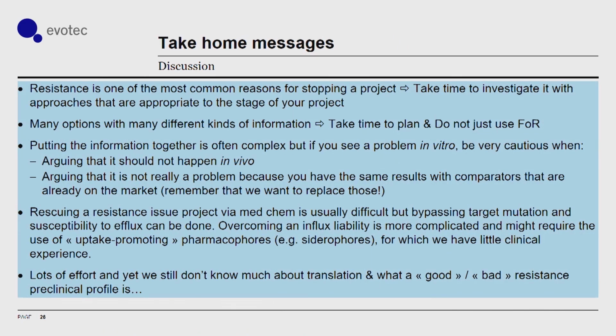So a few take-home messages, and I will leave them for you to read. But resistance is one of the most common reasons to kill a project. So do it. Take time to look at it. There are many options that give you many different kinds of information. Take time to plan, and do not just do frequency of resistance.